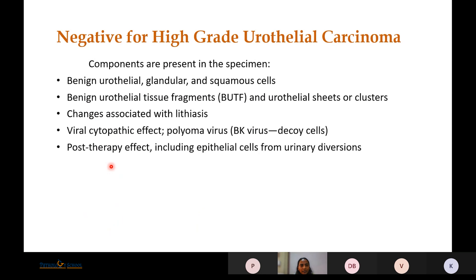Coming to individual categories, the first is Negative for High-Grade Urothelial Carcinoma. Components present include benign urothelial, glandular, and squamous cells; benign urothelial tissue fragments; urothelial sheets or clusters; changes associated with lithiasis; changes associated with viral infection, especially polyoma virus; and post-therapy effects.